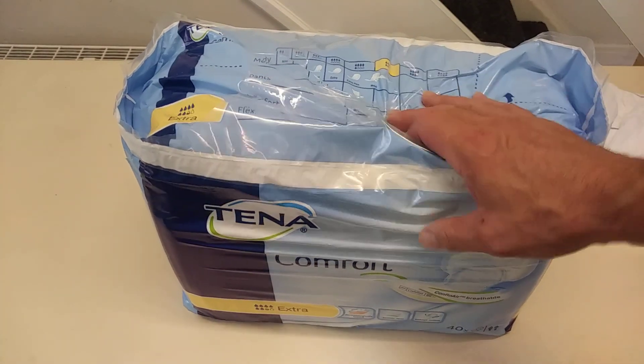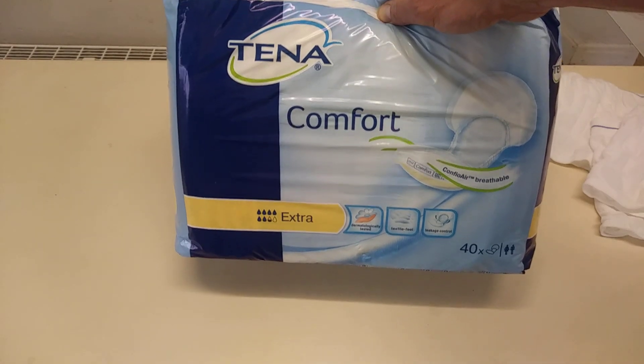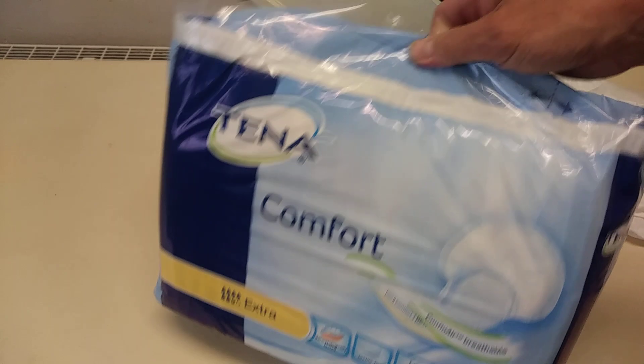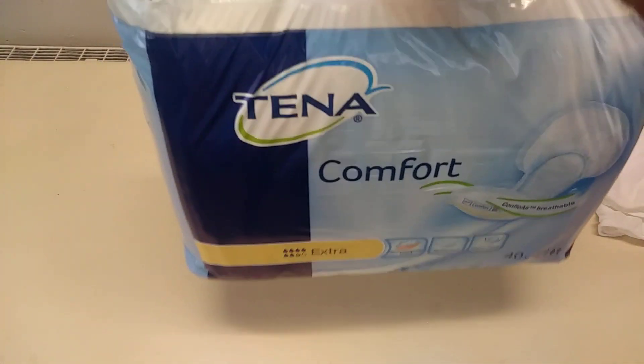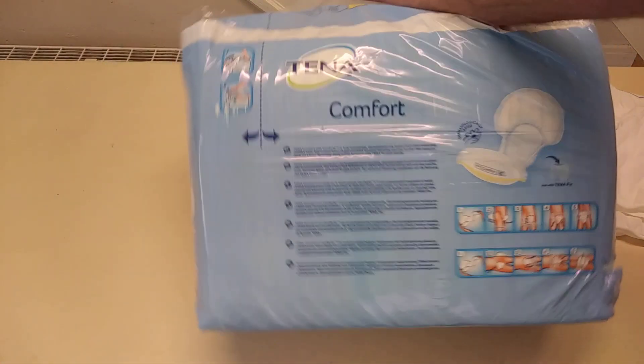Hi guys, it's Tony Green here. In today's description we're looking at the massive 40-plus pack of Tena Extra Comfort Pads for Men. This was sent to me, so I'm going to be opening this. It comes with a handy handle — almost looks like toilet roll — and that's what the back looks like.